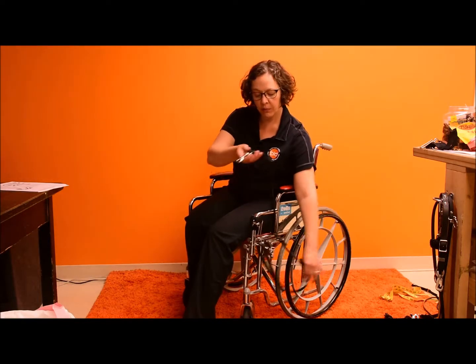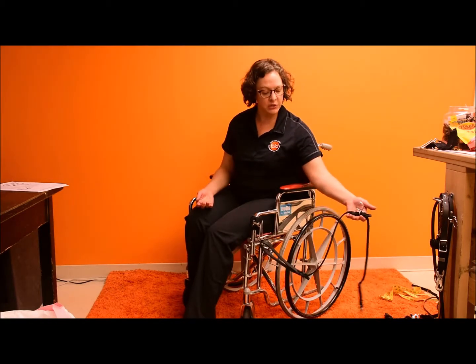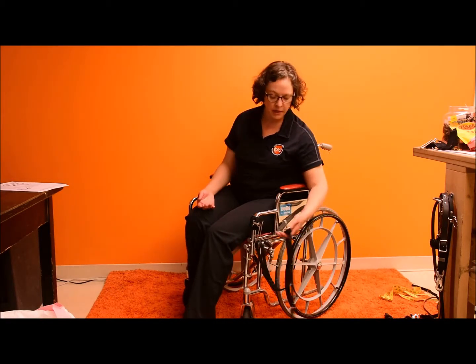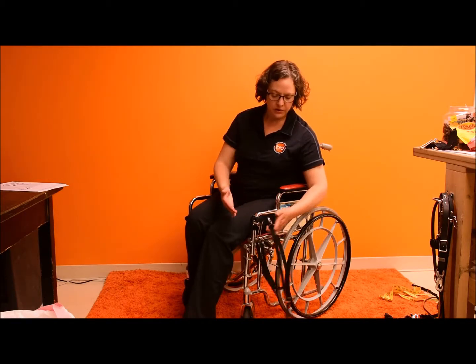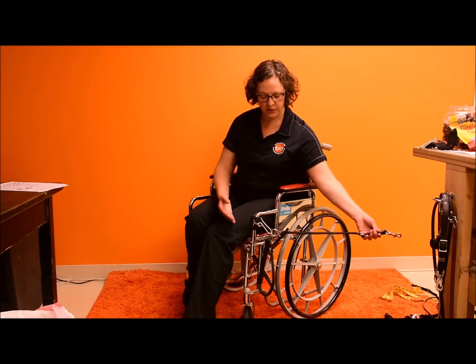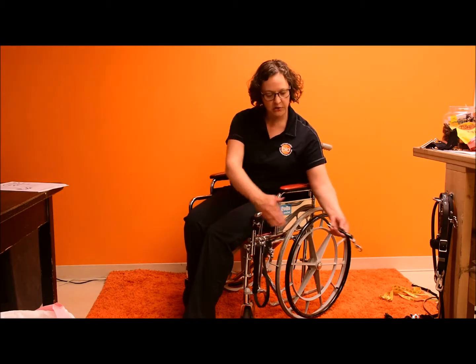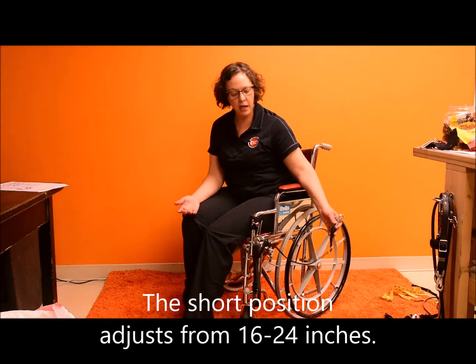Now, if you're going to be moving and the dog's going to be working at your side, you want to shorten the leash so that it doesn't get tangled in the wheels. So that's what this ring in the middle is for. This ring will drop onto the hook as well. And now you have a short leash, which from the chair to the dog's collar can be adjusted by several inches for a perfect fit.